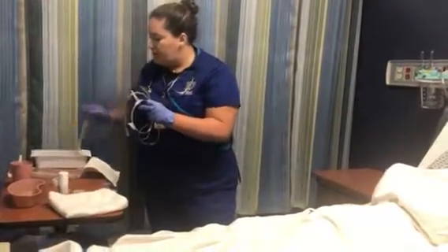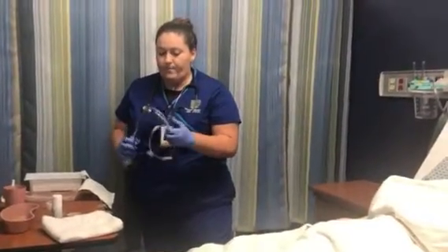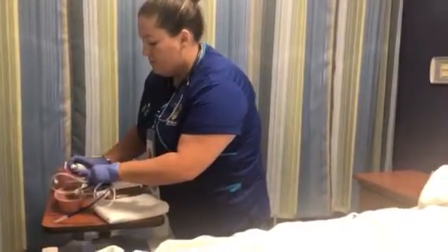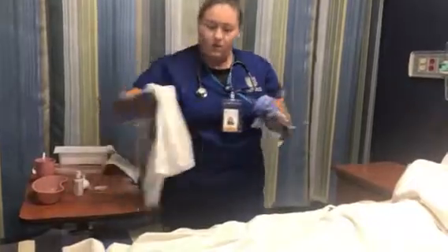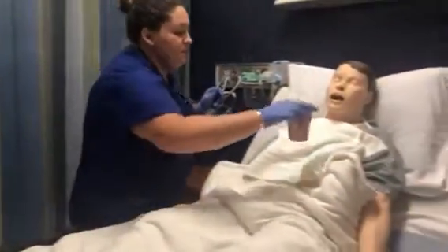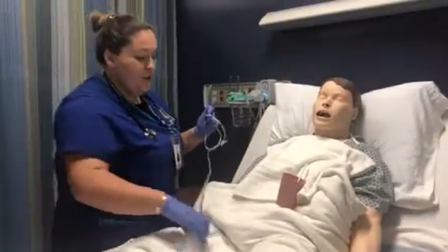Okay. I'm going to attach the syringe. And then lubricate tube up to 4 inches. I'll replace this in case there's any gagging or vomiting. Mr. Smith, if you can please just take a sip and swallow each time I insert the tube. And before I begin, I just want to set some communication with you.